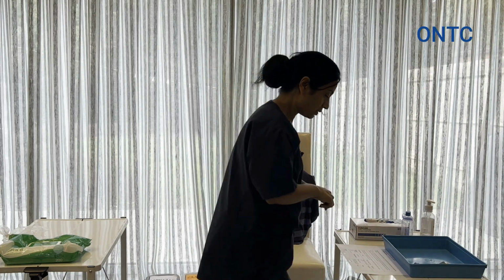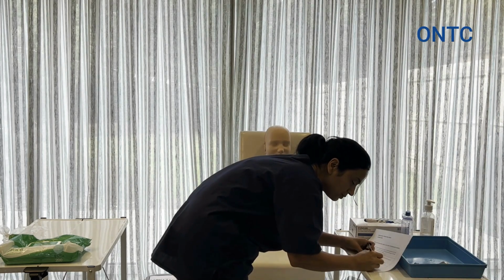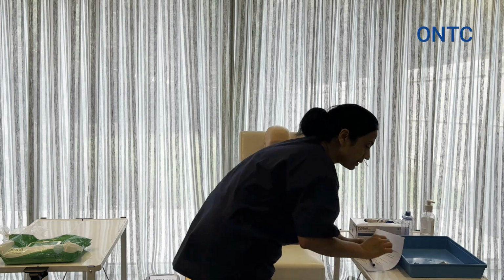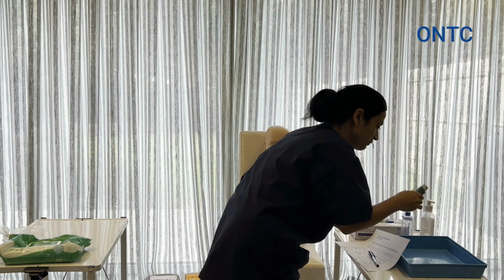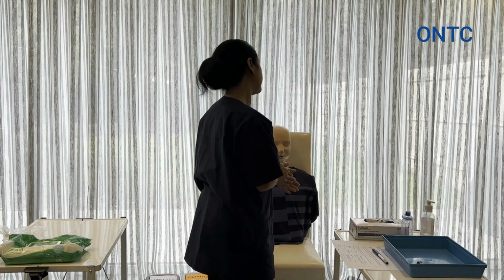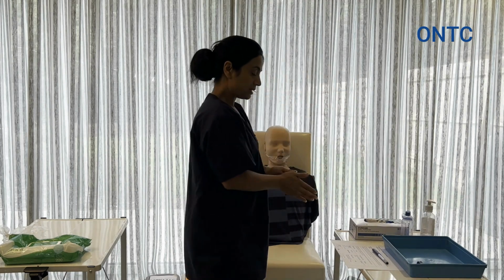Okay, so what we're going to do here is sign. So I'm just going to write my signature, and I'm going to write the date. Today's date, time is 12:30, which is the due time on the prescription, so I've given that. So inhaler examiner, I will store the inhaler as per policy, or if it's the patient's own inhaler, I will give it to the patient. So that's done, and are you feeling okay, Lawrence? Yes. Okay, so I will tell your GP that you had the dose as prescribed by your GP, and I'm just going to do my final hand hygiene.